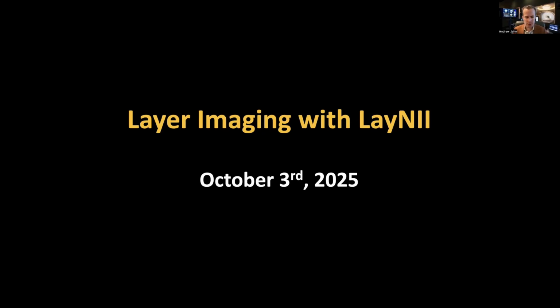The idea is the brain is composed of distinct layers in the neocortex, about 6. And also in certain areas, especially the visual cortex, it can be organized into columns. So at higher field strengths, higher spatial resolution, looking at a smaller region with fewer slices, could we possibly resolve the activity and the structure better within the layers themselves?